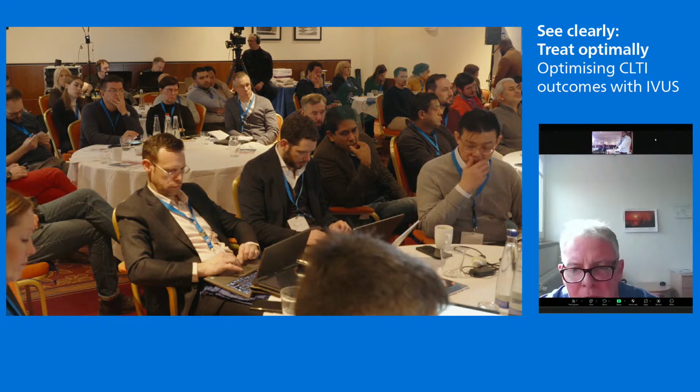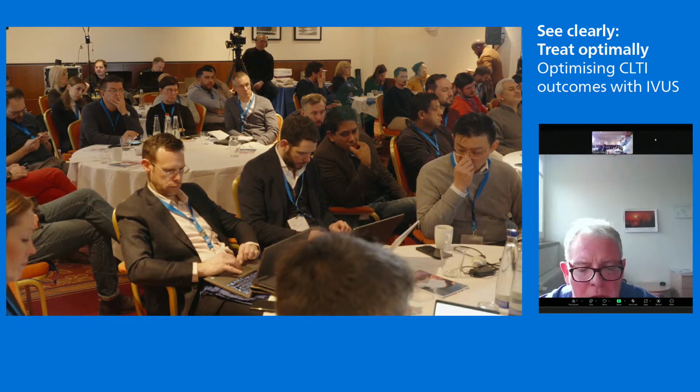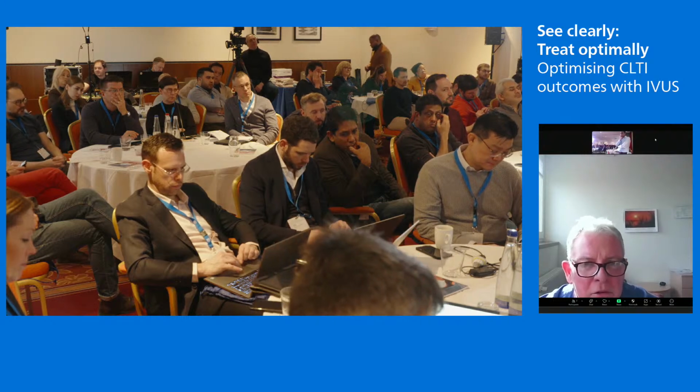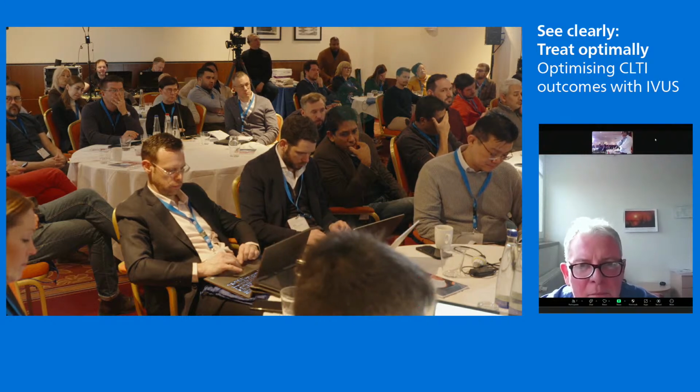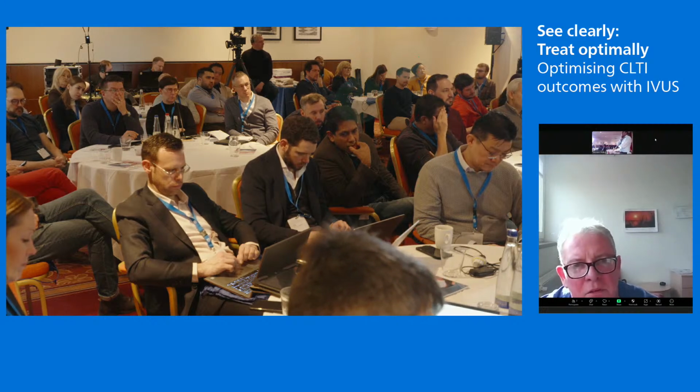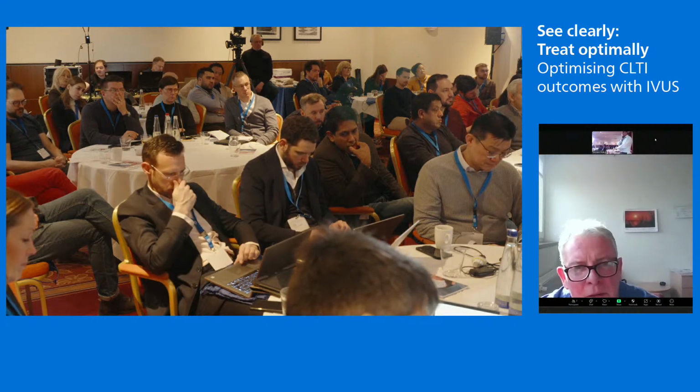Otherwise, you can use the hard tip of the wire just to pick onto the calcified plug and probably to move into the vessel and then proceed with the soft end of the wire.